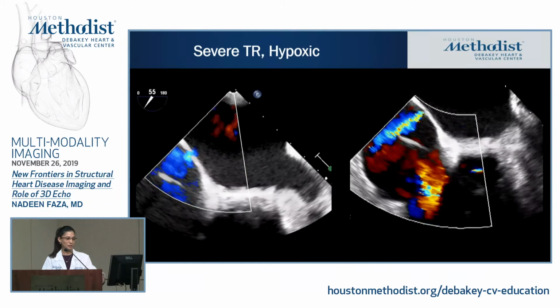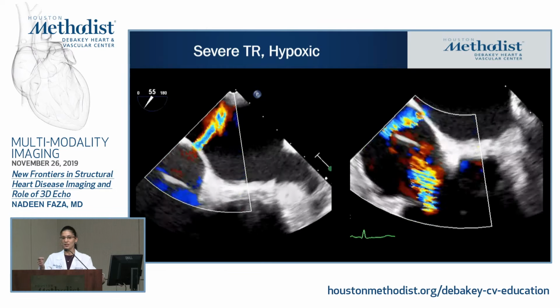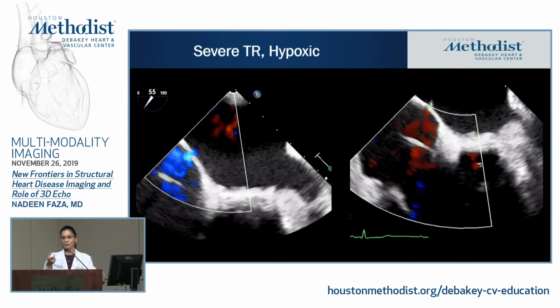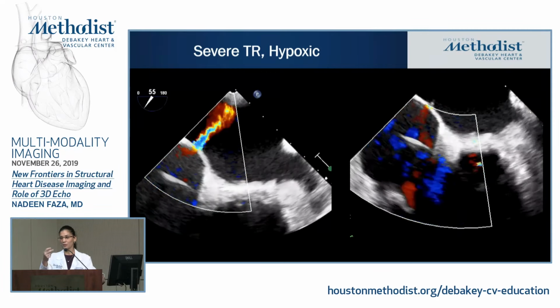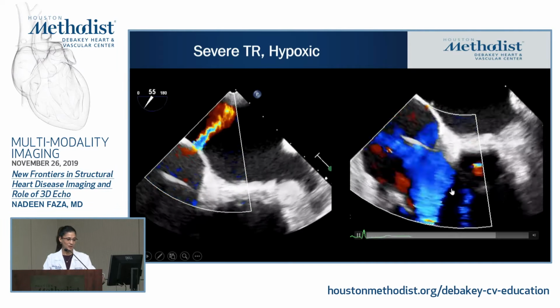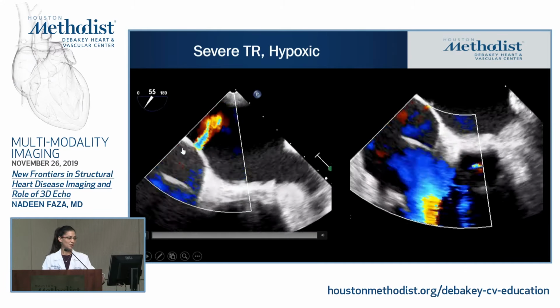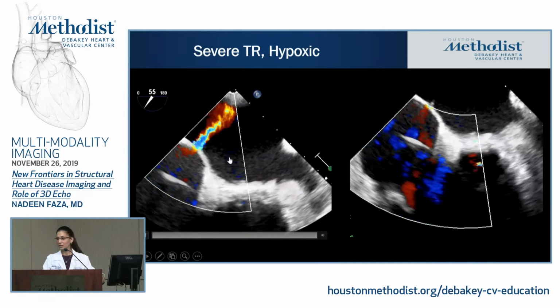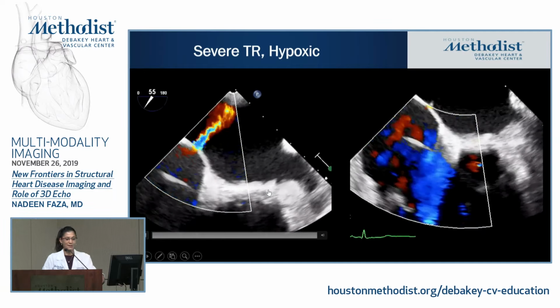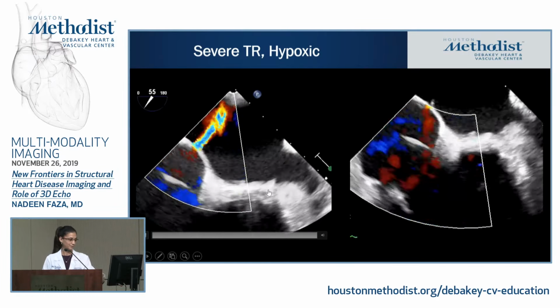This was a patient who had transcatheter mitral valve-in-valve. For these procedures, because you have to advance the transcatheter valve through the septum, you do a balloon septostomy. So you put a balloon through the septum to dilate it. This patient has significant TR. So in the setting of significant TR and an atrial septal defect, the patient developed this bidirectional shunt and developed hypoxia during the procedure. Based on that, the decision was to close the septal defect.